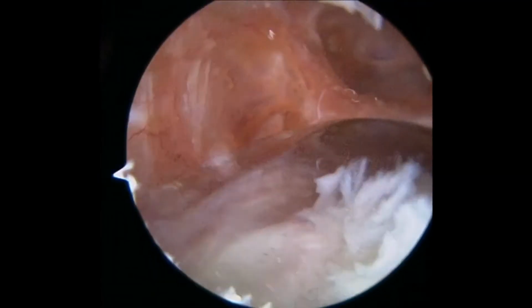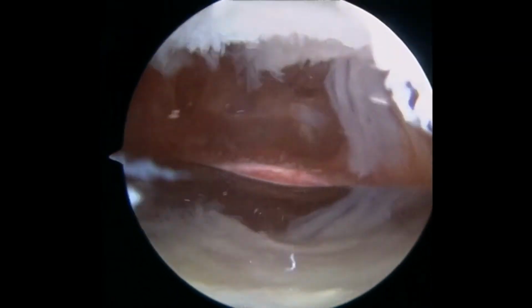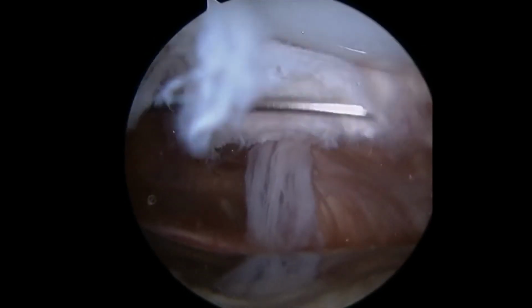And there's a condition sometimes people get after knee replacement called patellar clunk. And that's based on an old design from the 70s, and there was a transition in the metal that had a sharp edge, and that sharp edge sometimes would cause the tissue to get inflamed and clunk as it went from flexion to extension or extension to flexion.